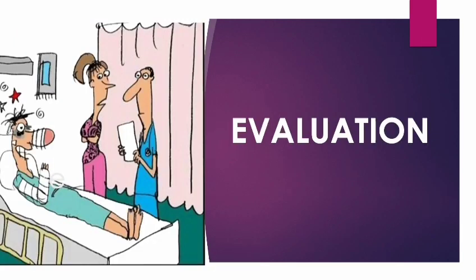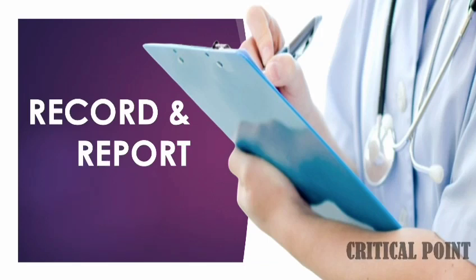Don't forget, always evaluate, evaluate, evaluate. This is to ensure that the procedure was carried out correctly and successfully. Coming to the last critical point, make sure that you record everything on all relevant charts, and also report everything to the sister. Don't forget, record everything in accordance with the record keeping principles.